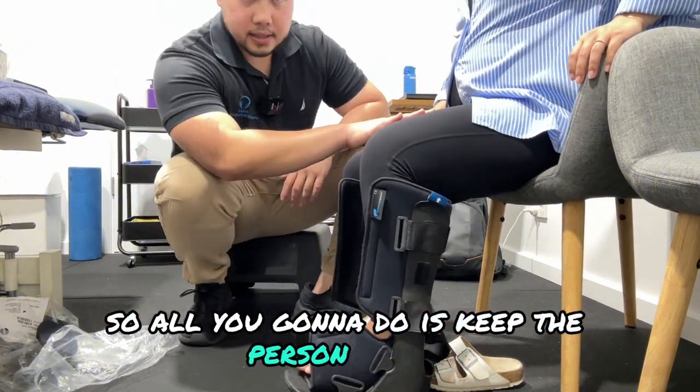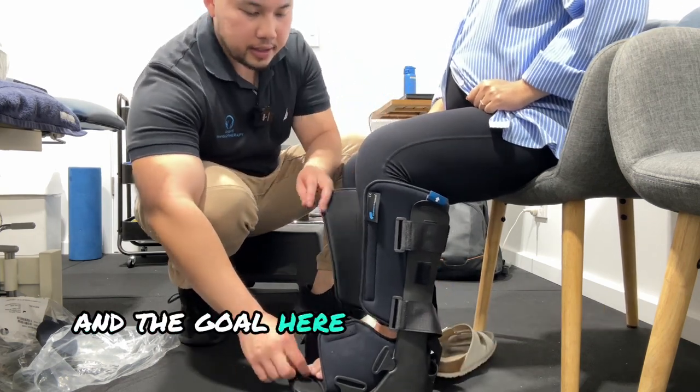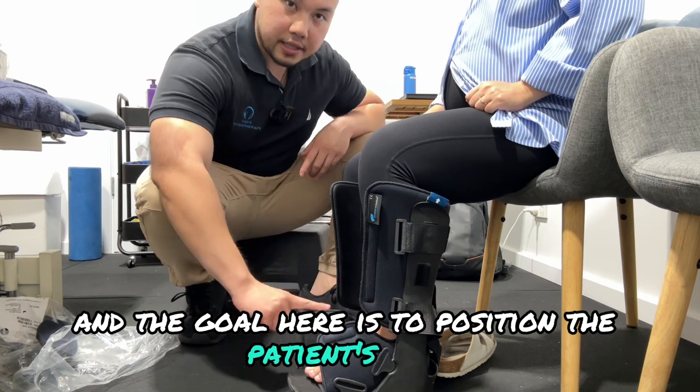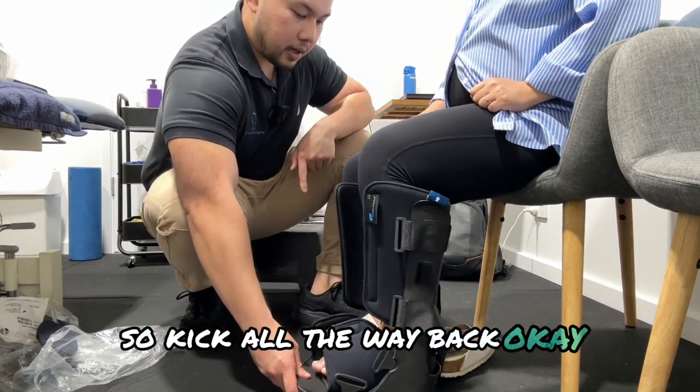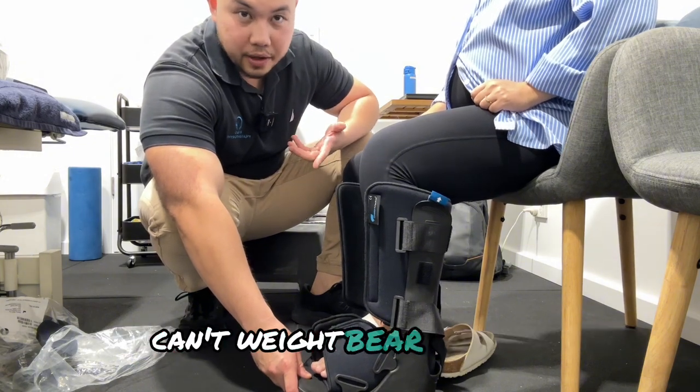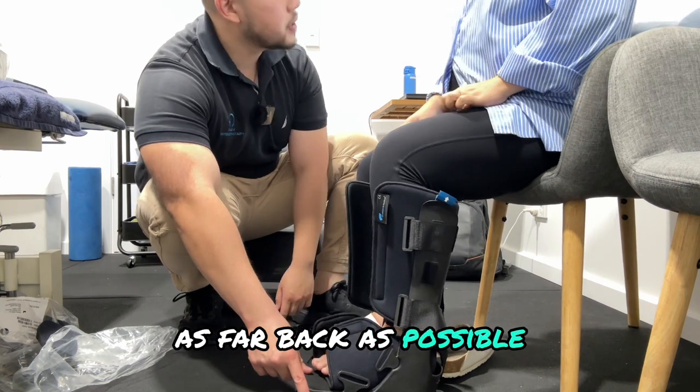Have the person seated and you want to bring their knees to about 90 degrees. The goal here is to position the patient's heel as far back into the boot as possible. It might be a bit difficult if someone can't weight bear as much, but you just try to get them to slide their heel as far back as possible.